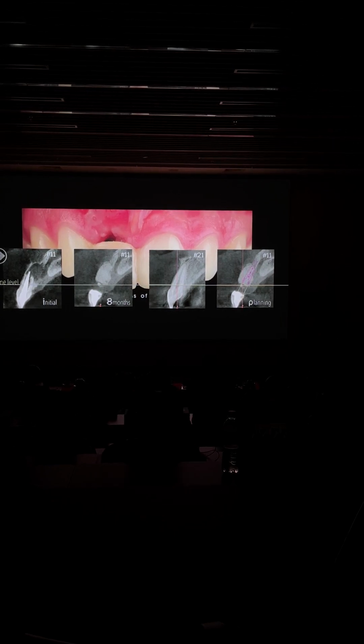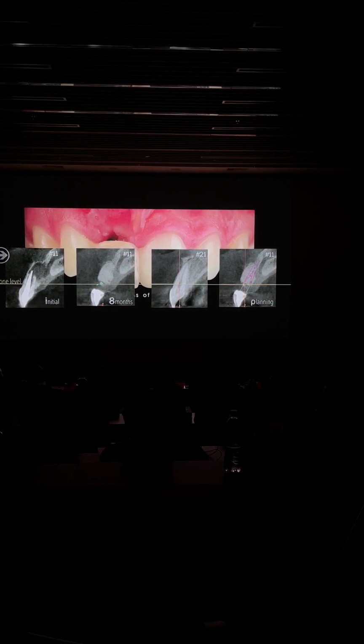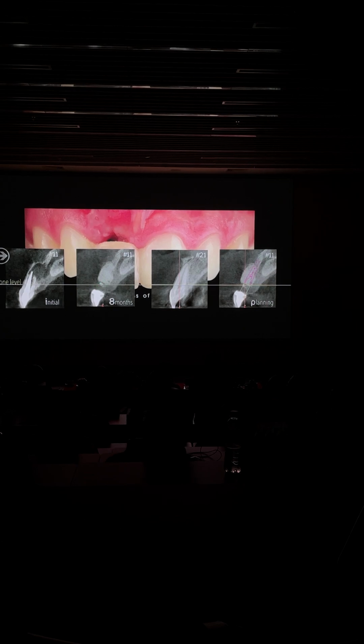You can see here that it is a soft tissue problem. It's rather easy. What I like about grafting same day is that the quality of the bone is much better than if I don't graft crestally, because this tissue is thicker, is coming from another part of the mouth.